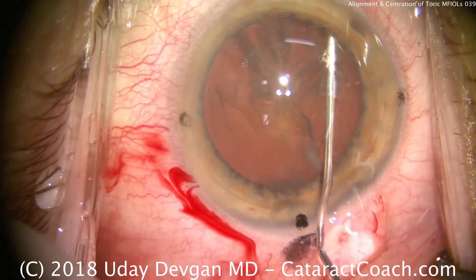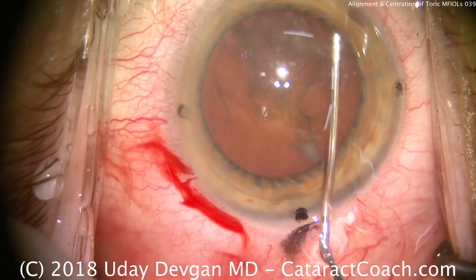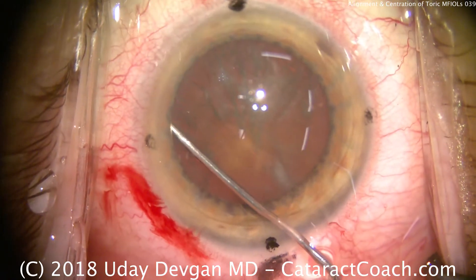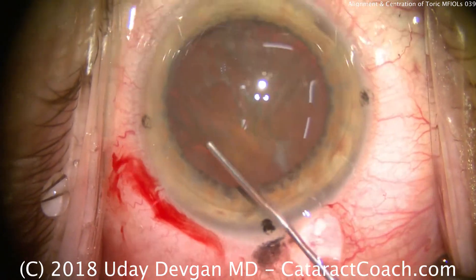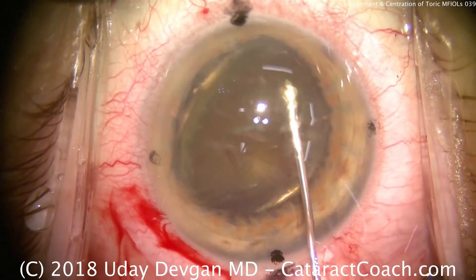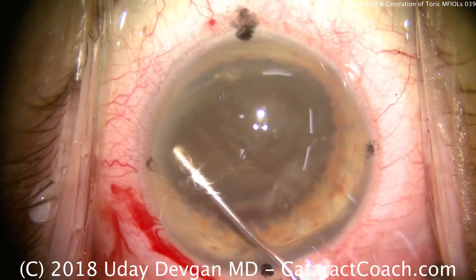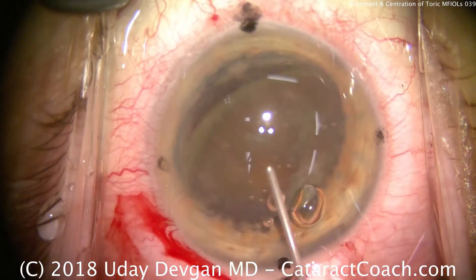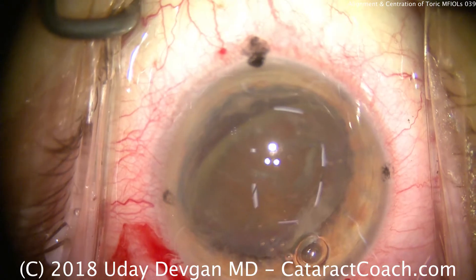Balanced salt solution for some hydrodissection. Here we're loosening the cataract from its attachment to the capsule, and we'll do that again in the other direction. Now the nucleus slightly prolapses out of the capsular bag, which is great — it's going to make it very easy for us to access. We'll recoat the corneal endothelium with viscoelastic just for safety.